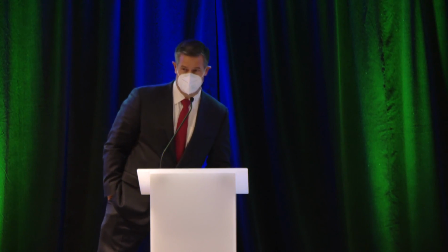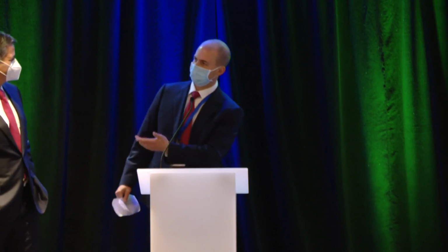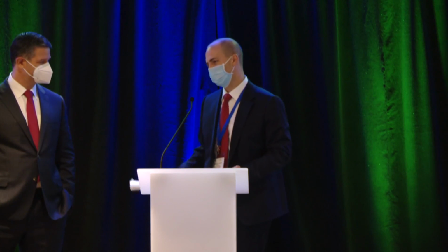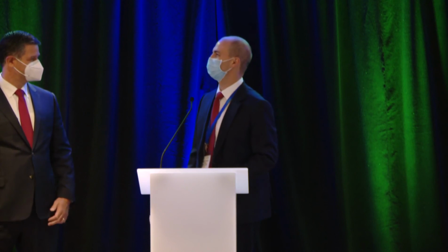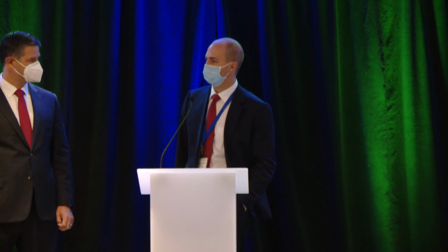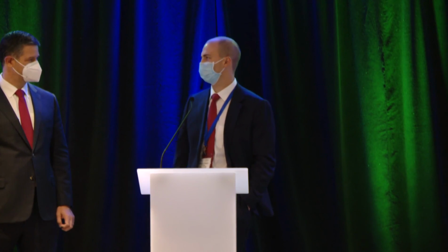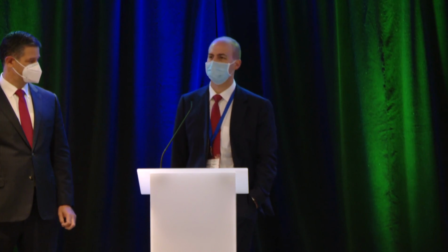Clearly, they do exactly what I do. Well, that's actually supported. It goes back to what the patient's symptoms are, but that's supported by evidence. The vast majority of patients, you can tell that they've got pressurization and you're not crossing the LES. But when it's in question, it's not uncommon for us to go ahead and pass it endoscopically, especially if it's an outside provider and we want to make sure we know what's going on. It makes a big difference whether it's my patient versus someone else's patient, for sure.